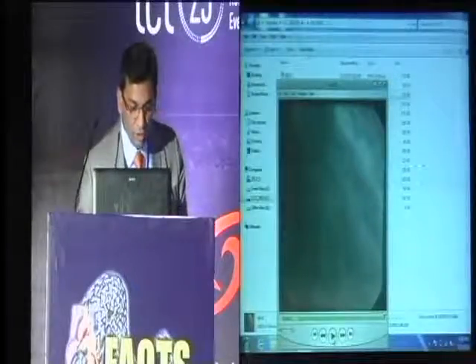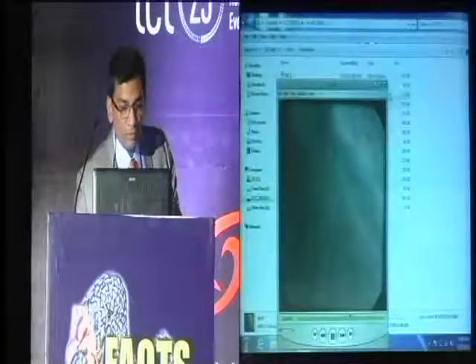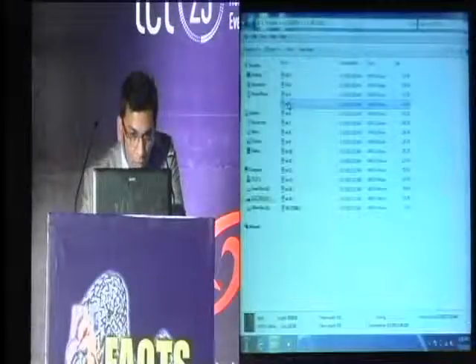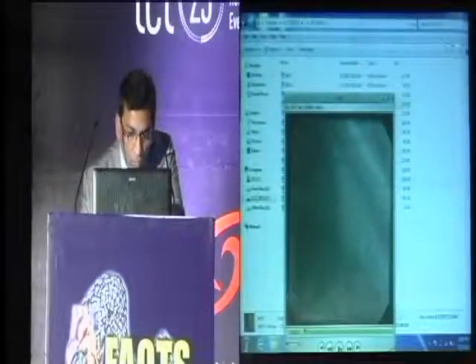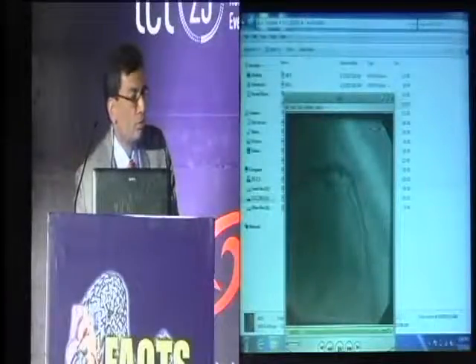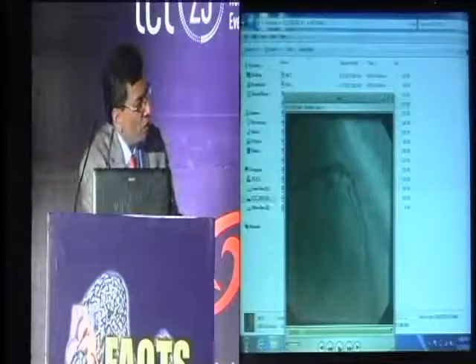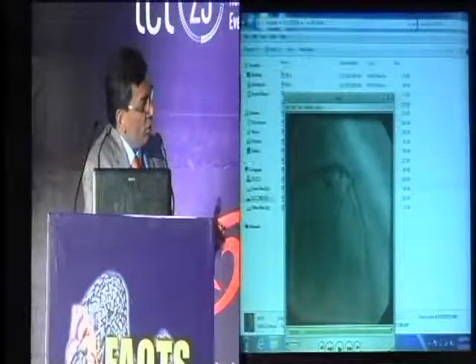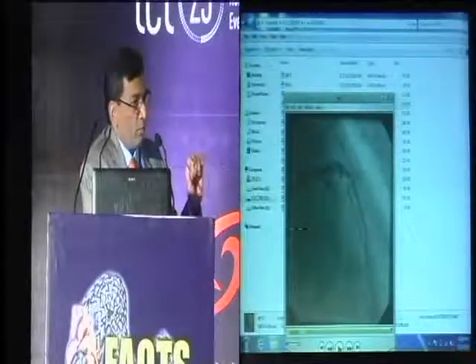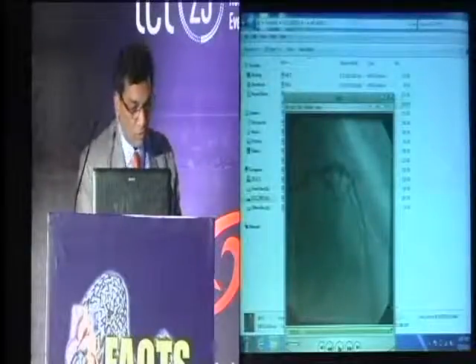So that's a cine of the Export thrombus aspiration catheter. That LAD opened up. This not only allows the patient to stabilize hemodynamically, it also gives a better chance of wiring the diagonal, which is again totally occluded with a lot of thrombus.